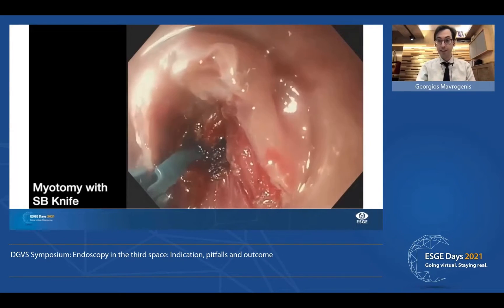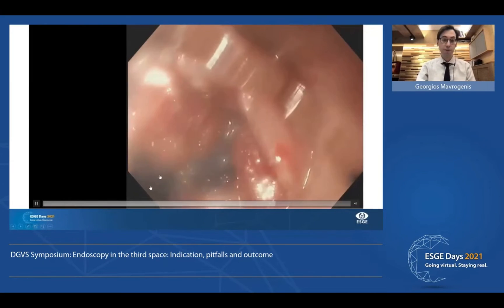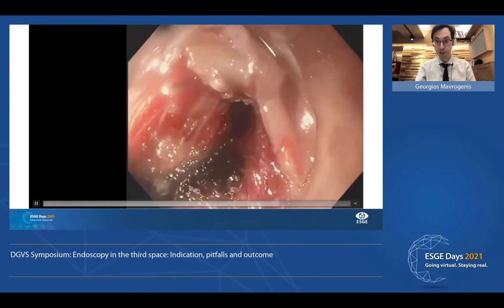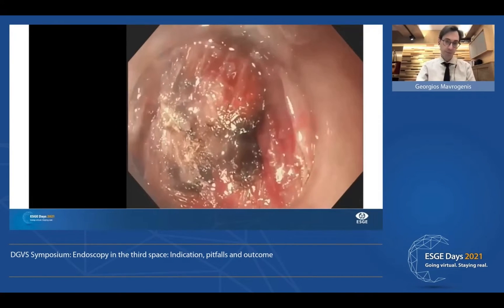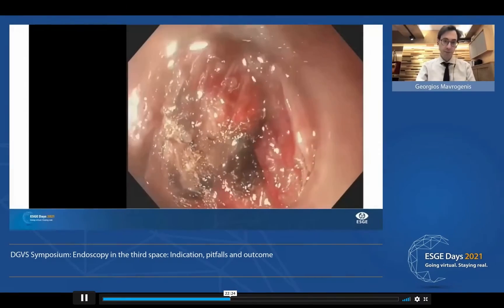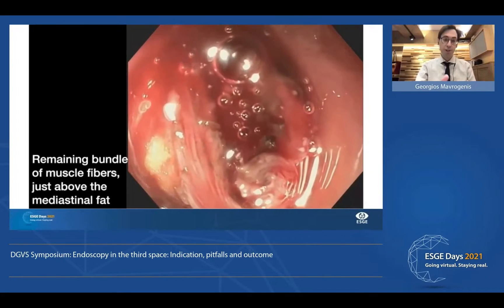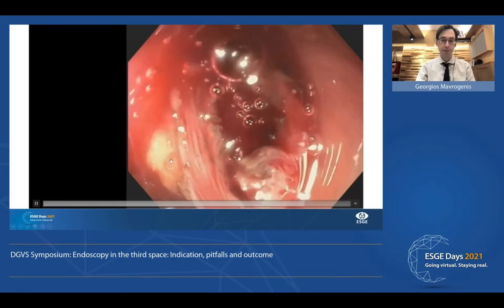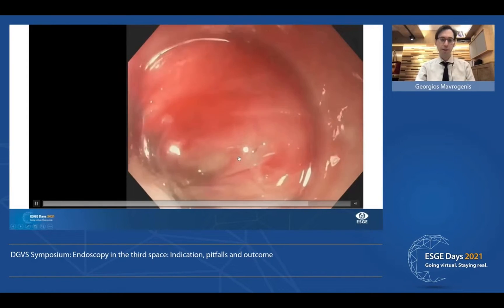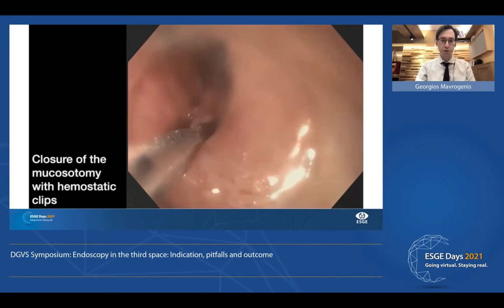We cut the bundles of muscle using the same knife or a scissor-type knife with insulated extremities. We go as deep as necessary until we see fat or until we see the last bundles of muscle — here, this is fat. Then we cut the remaining fibers and close our mucosotomy with clips. That's it.